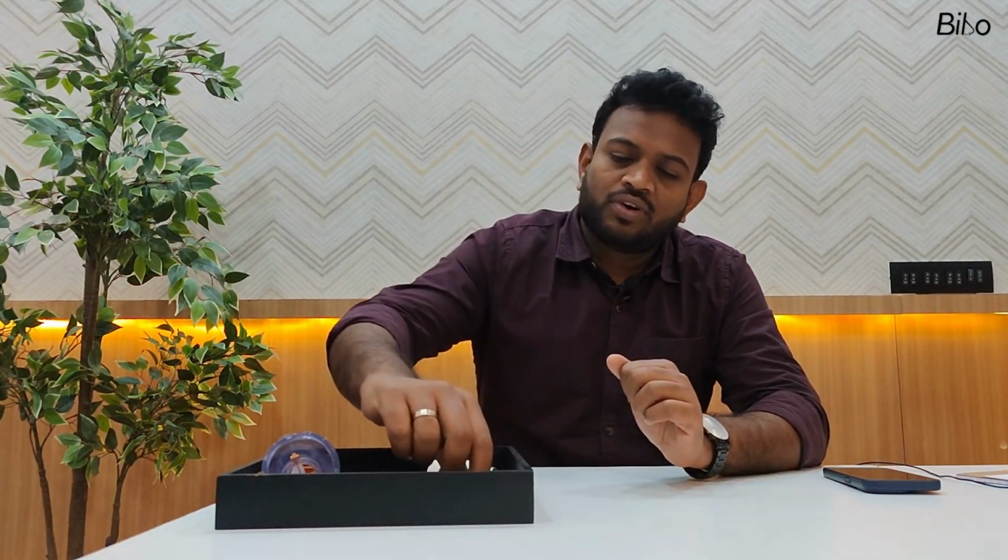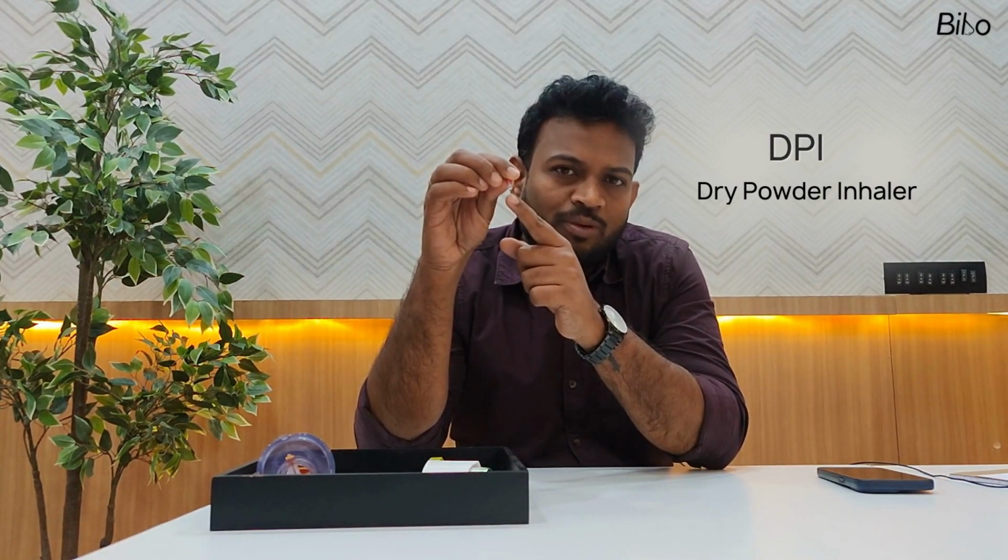We will be discussing the correct way of taking any inhaler. So first I will be discussing the DPI. DPI, as I have already shown, is a capsule which will contain a dry powder. DPI by definition is dry powder, so it is available in the form of a powder.